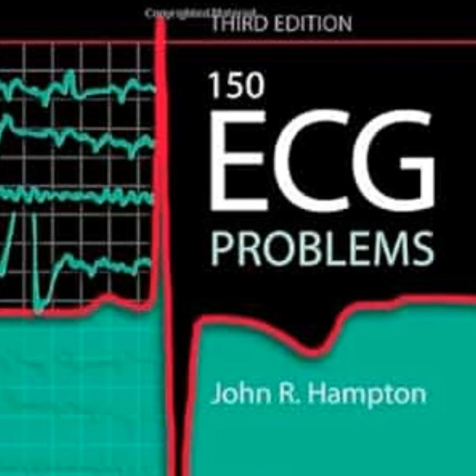You really can't. I mean, the ECG is a phenomenal tool, right? It gives us this rapid, non-invasive look at the heart's electrical conduction system. Yeah, which is amazing. It is. But relying on it without the clinical context is a really dangerous game. And that brings us to Hampton's golden rule for this whole deep dive, which is that the patient's history and their physical exam always have to dictate your interpretation of the tracing, not the other way around.